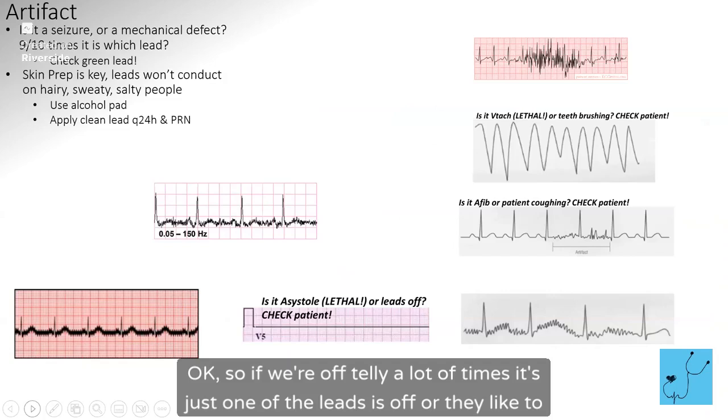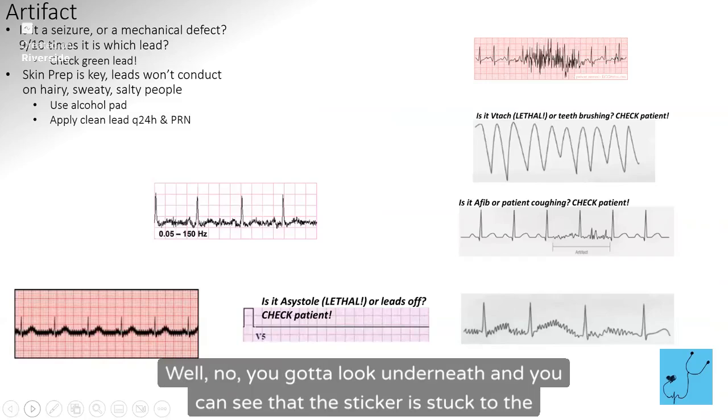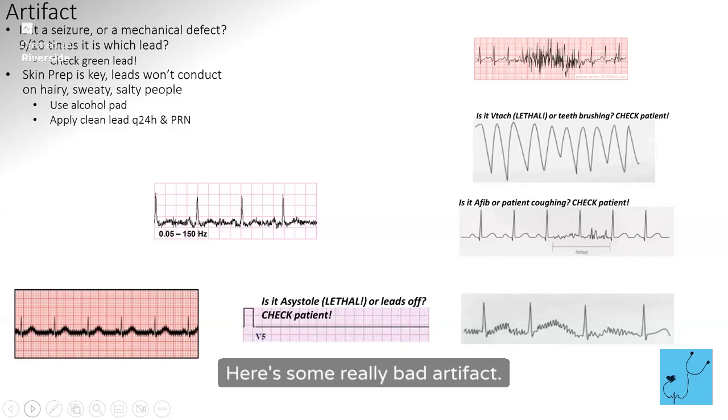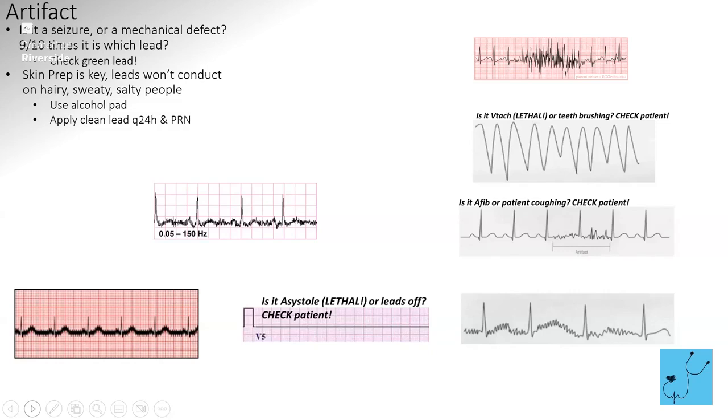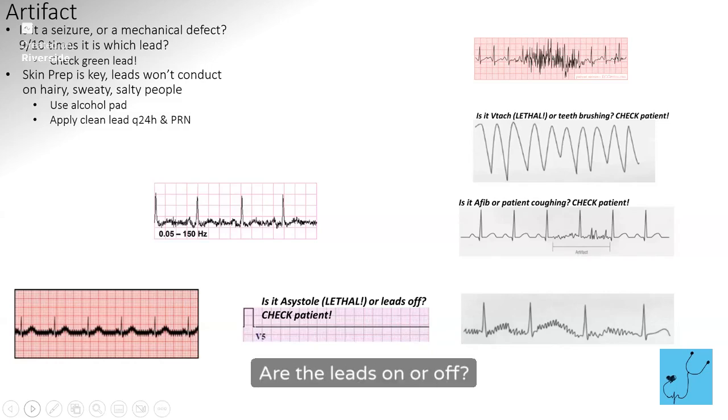If we're off tele, a lot of times it's just one of the leads is off, or they like to flip around and stick to the inside of the gown. And then it's like, no, their leads are on. Well, no, you have to look underneath and you can see that the sticker is stuck to the wrong spot. Here's some really bad artifact and more bad artifact. Most asystole doesn't look like an exact straight line, but it's definitely something we have to investigate and look at the patient. Are the leads on or off? And see where we're at.